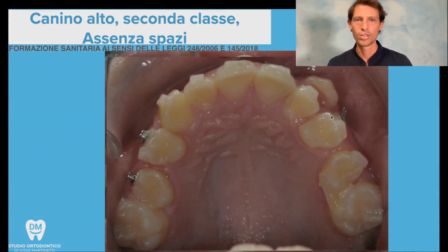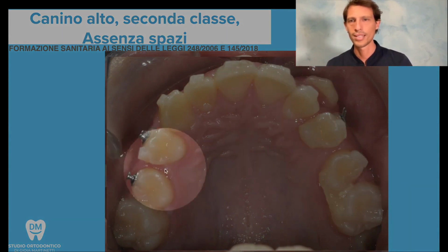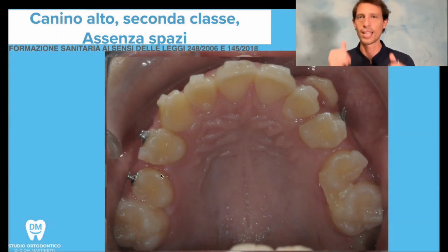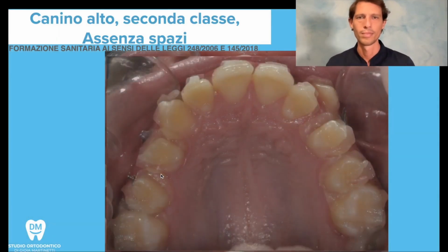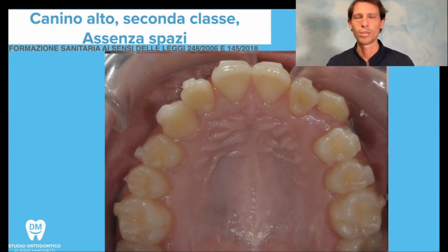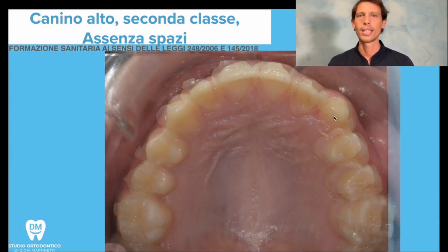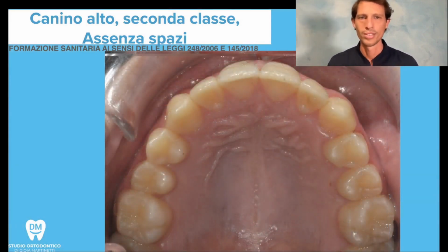Then, little by little, we start to push these teeth back, changing the aligners, and you can see that spaces begin to open up precisely because the teeth are moving further and further back. You can see they keep moving further back, the space keeps opening up more and more, it opens up even more, and now we're almost there. And in the end, this canine finally manages to find its space among all the others.